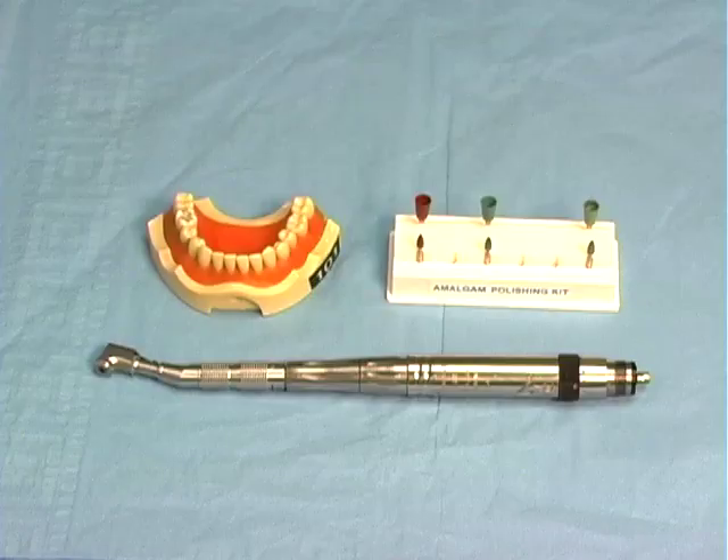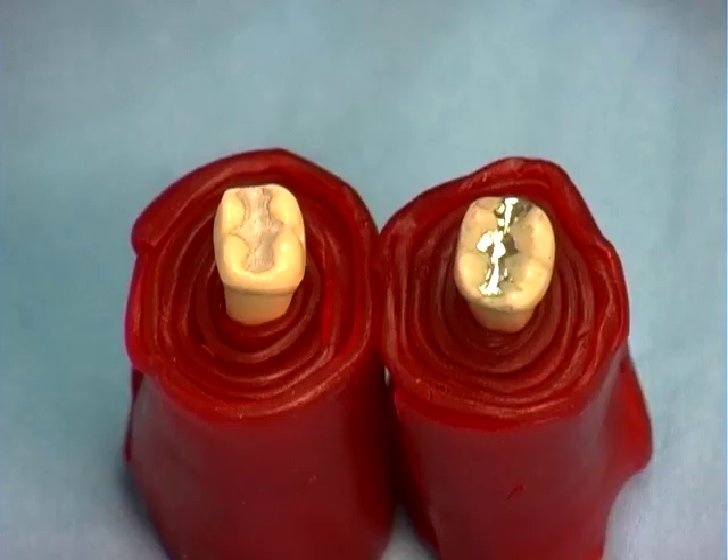This video will demonstrate amalgam polishing on a typodont. An amalgam can be polished 24 hours after placement. Here is an unpolished amalgam on the left, compared to a polished one on the right.